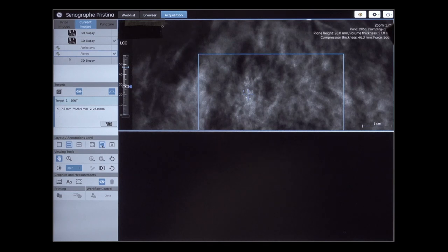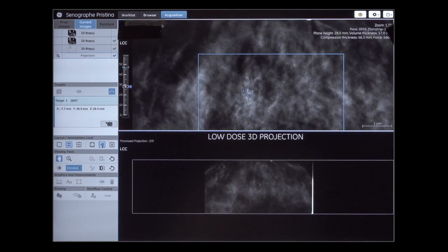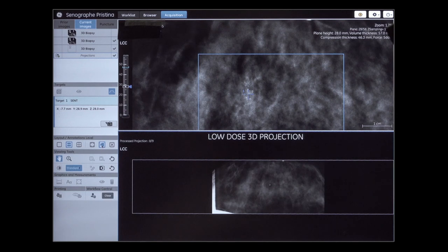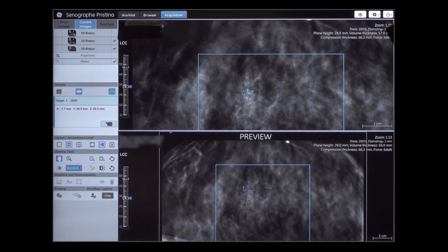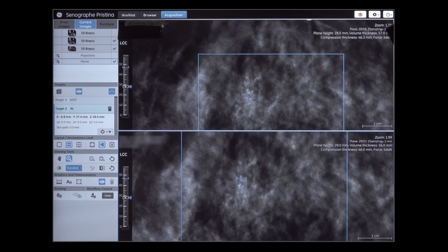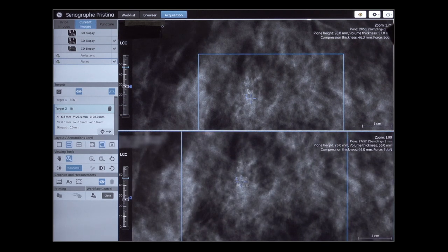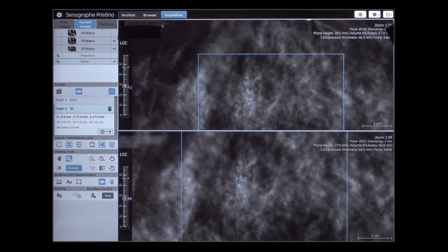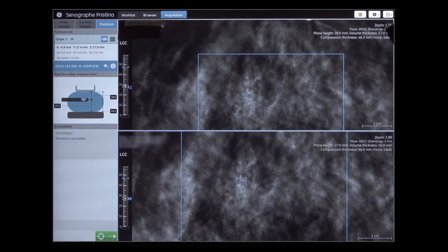Remove the laser. A new 3D biopsy sequence is taken to double-check lesion coordinates, since they may have shifted after anesthesia. 3D projections followed by the preview reconstruction are displayed. Duplicate the target to reposition the target cursor according to the new lesion coordinates. Zoom the image if necessary. Check lesion coordinates and accessibility, then send the new target coordinates.